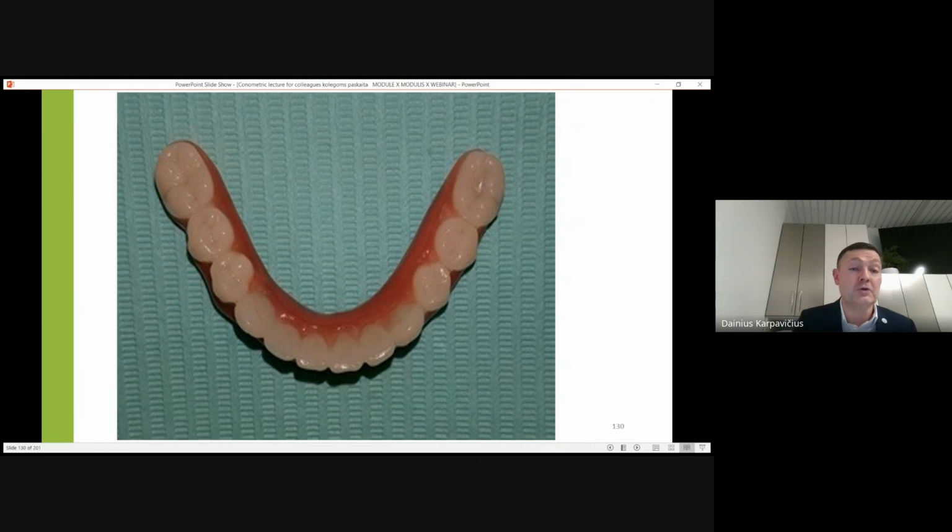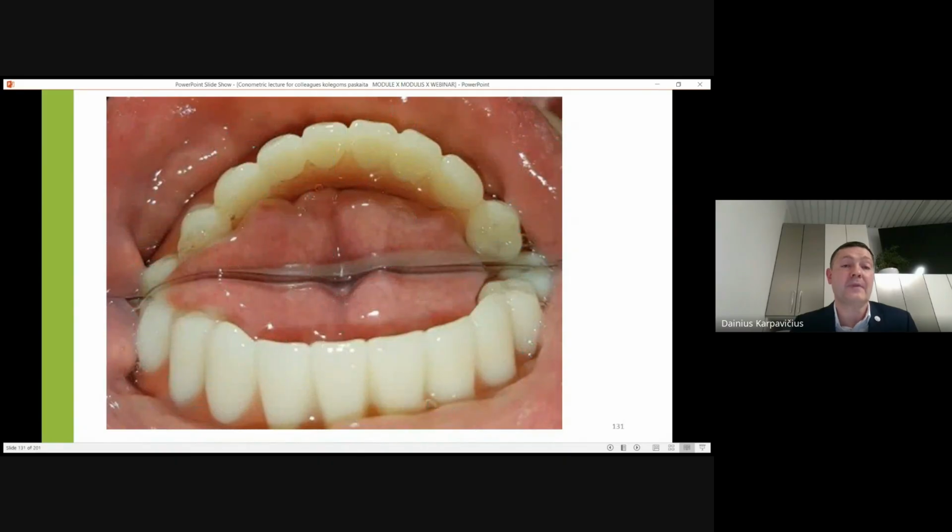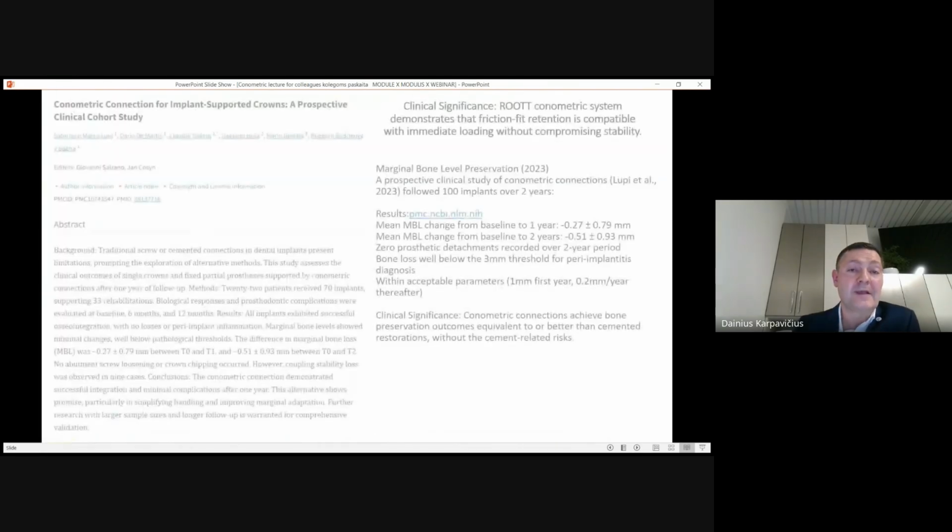Meanwhile, if it were multi-units, we would have to open 4 or here 6 holes to take out the Teflon, unscrew, take out, put back, screw everything. It's very difficult with her. So sometimes these solutions are very important, very mandatory for service mode, as I said previously. And again, the thickness of the prosthetic is also very nice.